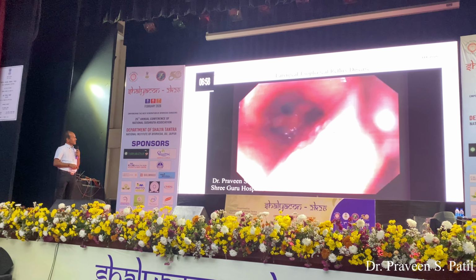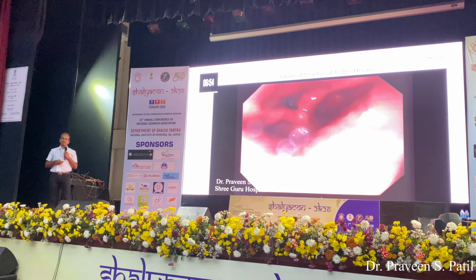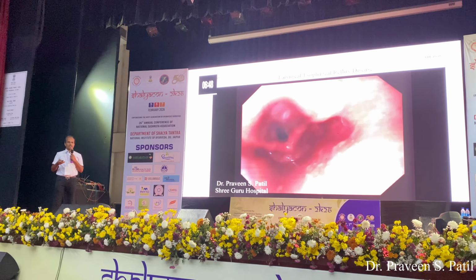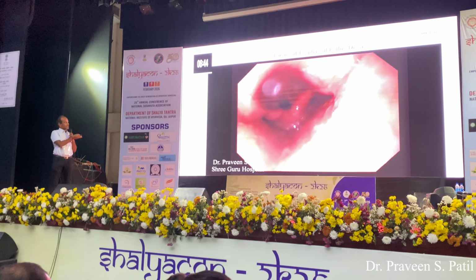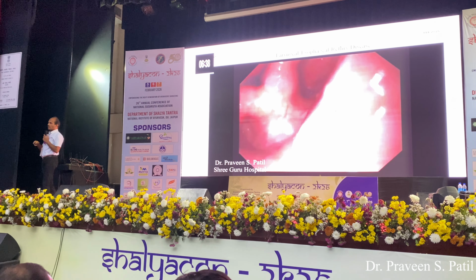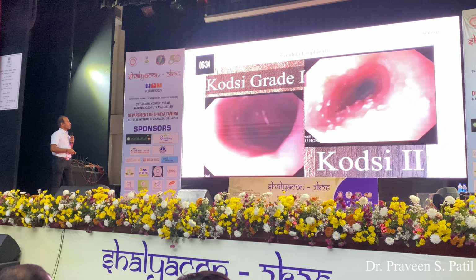Here is another case, say laryngopharyngeal reflux disorder. Most of the patients who come with a cough are not responding to the common treatment of cough and asthma. That is the result of the Amlapitta. Here you can see the edematous mucosa in the pharynx. See, this is such a tool. We have not yet entered into the esophagus, but we are diagnosing many cases.